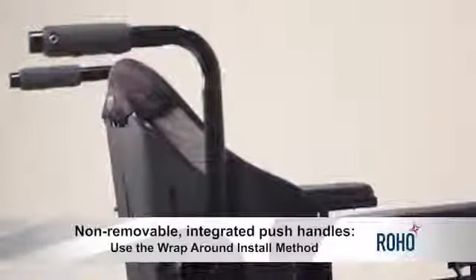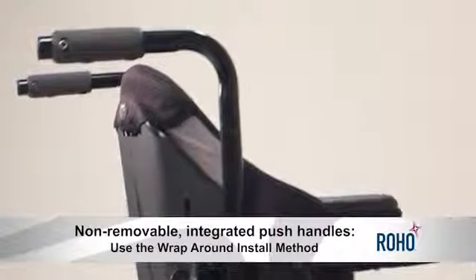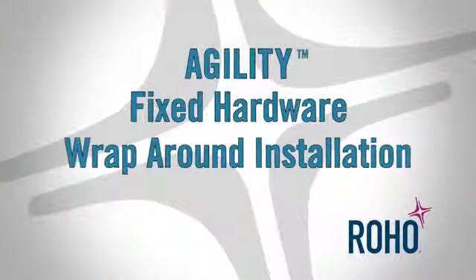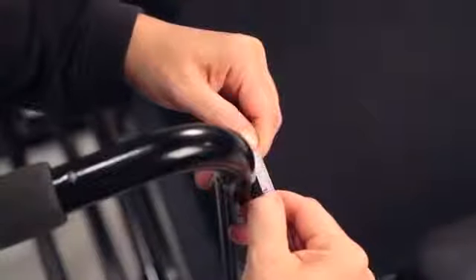If the wheelchair you are fitting has non-removable, integrated push handles, you will use the wraparound install method. To start, determine the diameter of the wheelchair back canes. If the cane has a 1-inch diameter, you will proceed with the fixed hardware just as you received it. Begin the installation by loosening the hardware bolt without completely removing the bolt from the adjustment cylinder. You will want to loosen the bolt as far as possible without removing it.